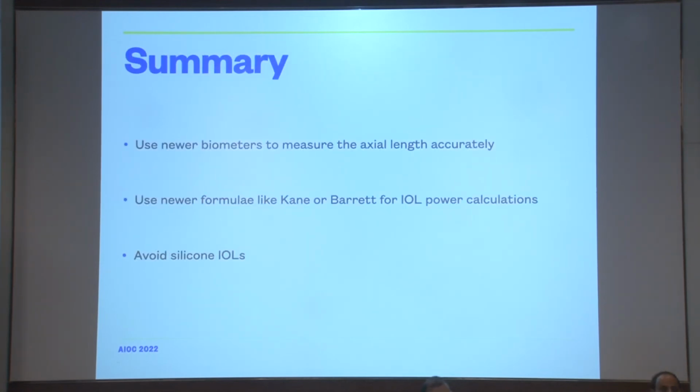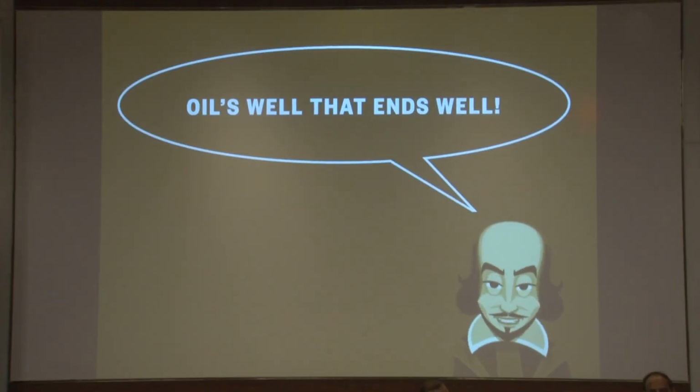Use newer biometers to measure the axial length accurately. Use newer formulae like Kane or Barrett for IOL power calculations, and avoid silicone material of IOLs. So as Shakespeare would put it, oil's well that ends well.